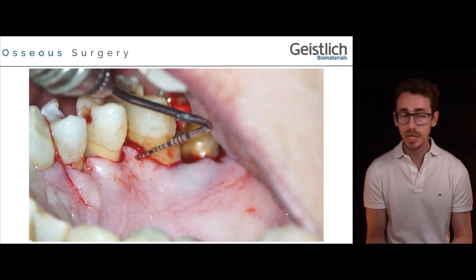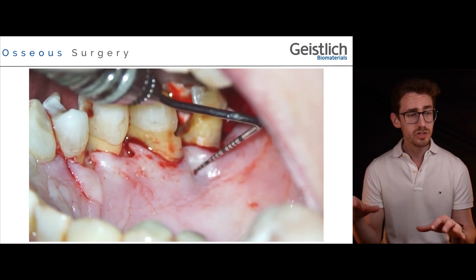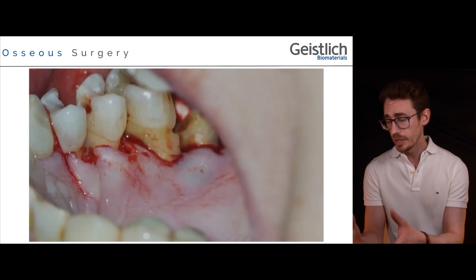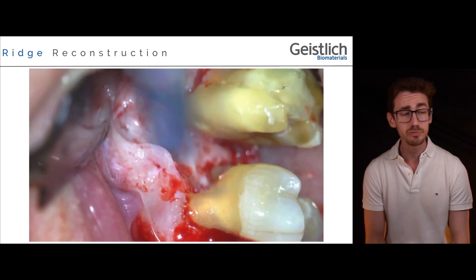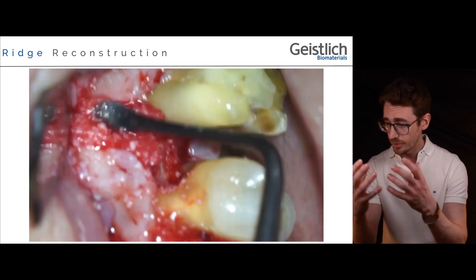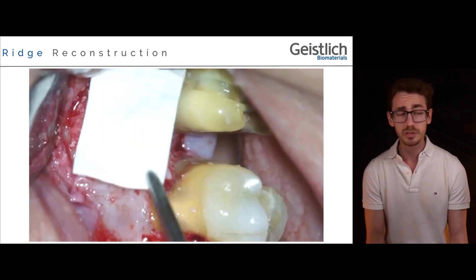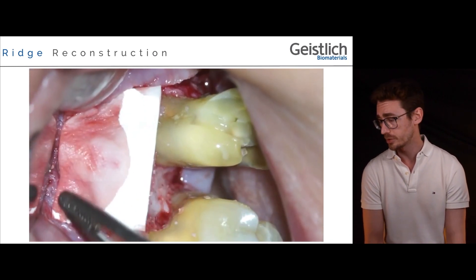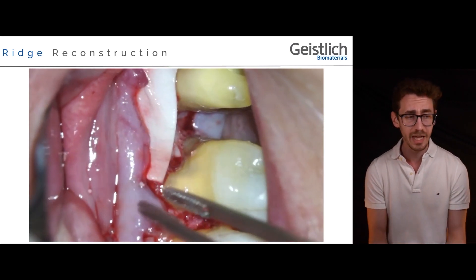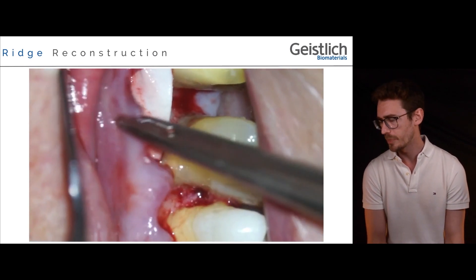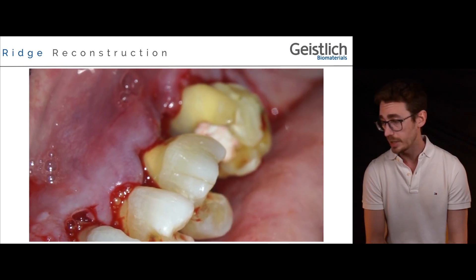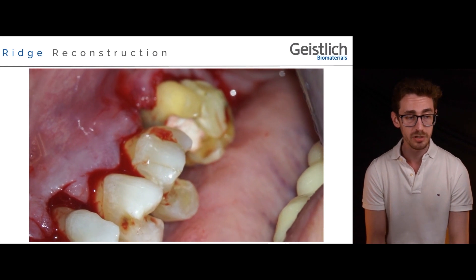Once osteosurgery is performed, the adaptation of the soft tissue is checked with the periodontal probe to confirm adequate interproximal closure through the combination of the thin palatal flap and the osteosurgery. We then move back to the buccal aspect to treat the post-extractive defect on the distal aspect of tooth number 26. With the primary aim of avoiding soft tissue collapse within the defect, the ridge is reconstructed with a collagenated bovine bone mineral graft — Bio-Oss Collagen — combined with a BioGide membrane. The graft was adapted in the defect and the membrane placed to provide mechanical stabilization and prevent soft tissue infiltration; as no over-contouring is created, no tags or pins are needed.